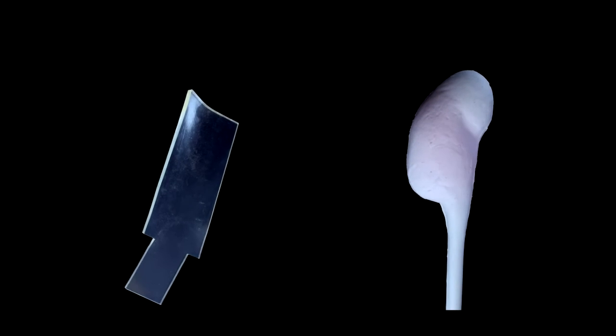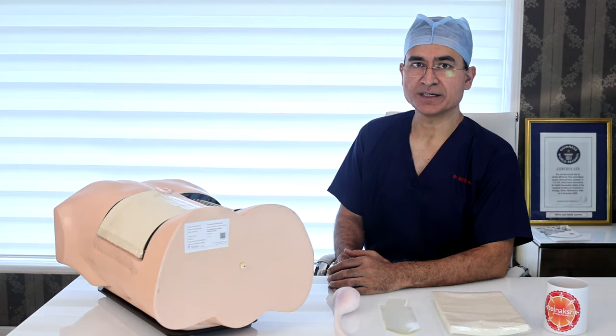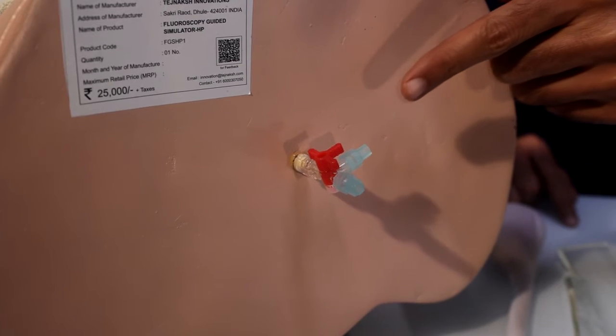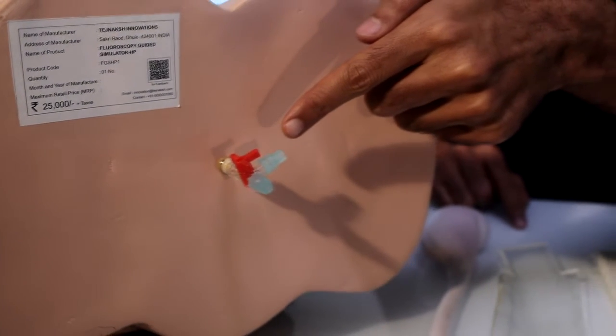Inside we have provided a replaceable kidney insert which is placed in a tray. The provided kidney does not need contrast for visualization. During the puncture, one can inject water through the ureter and get a water drip on a successful puncture.